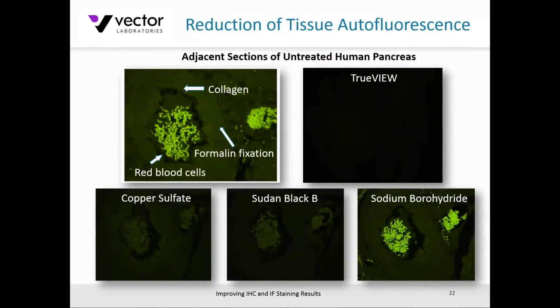Now, what I've got here on this particular slide is a series of essentially adjacent sections of human pancreas with various treatments. And there's quite a number of treatments out there that investigators have used over the years. Copper sulfate is one, tends to wash off quite readily, unfortunately. Ink-based reagents that aren't particularly effective against some of these other tissue elements. And this dreadful sodium borohydride, it bubbles, it's horrible, it's got a short half-life and does absolutely nothing to quench red blood cell autofluorescence. What we've done is we have developed a product called TrueView.